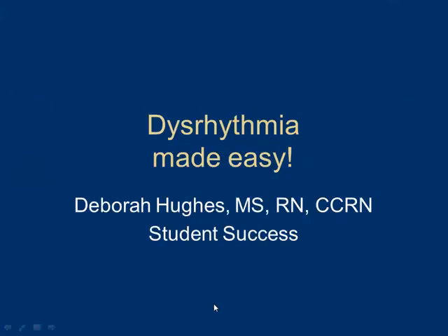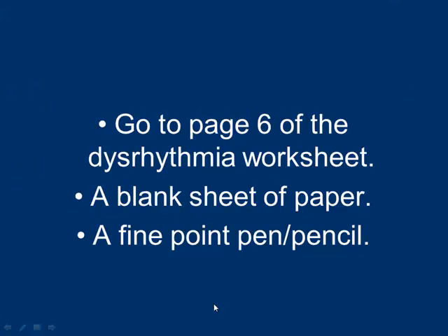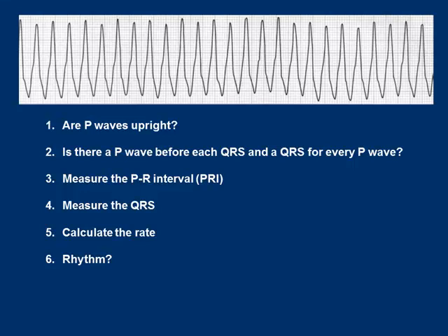Hello everybody, we're back to Dysrhythmia Made Easy, and now we're going to talk about the ventricular and arrest rhythms. If you're interested in doing your worksheet, we begin on page 6.